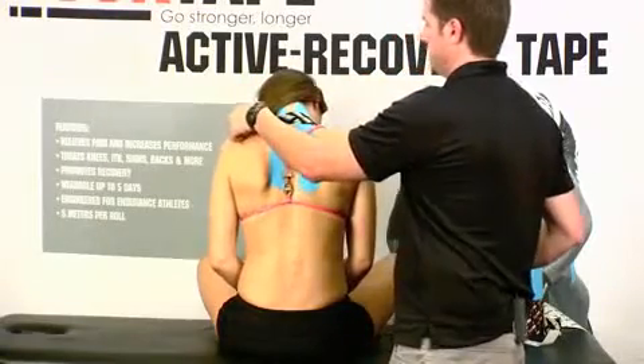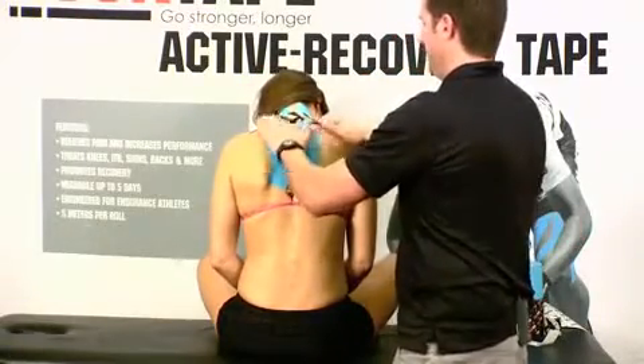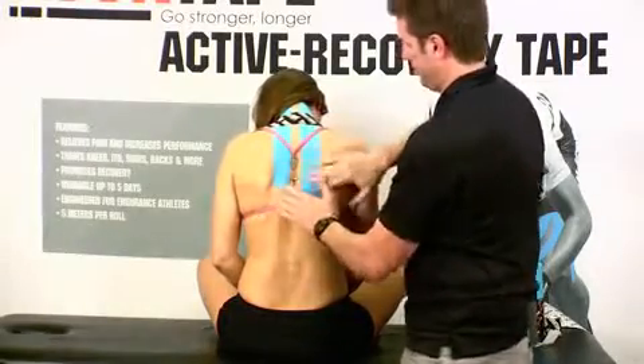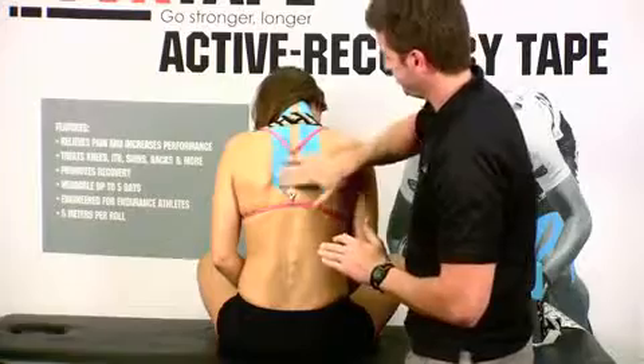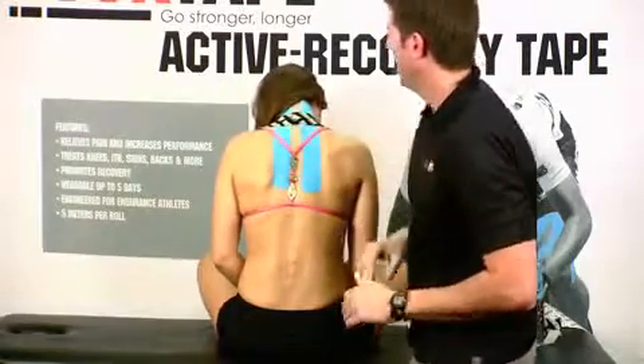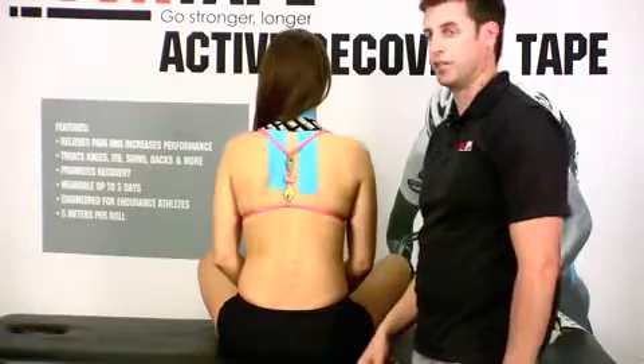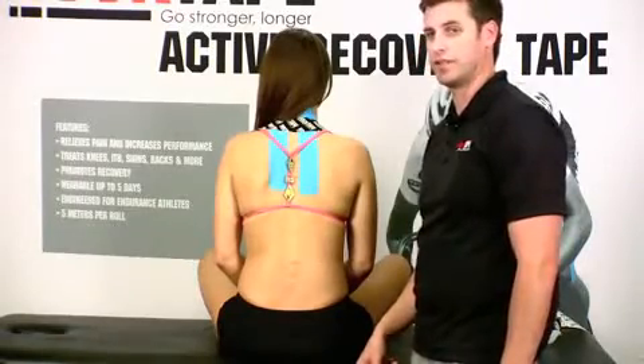Same thing — no tension whatsoever on that side. Go ahead and rub to activate that adhesive. And that's how easy it is to tape cervicalgia or neck pain using RockTape. Go out and have some fun.